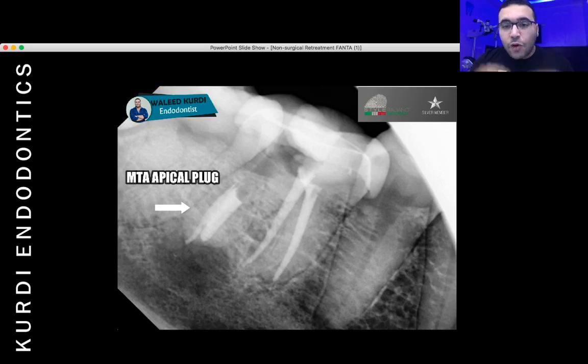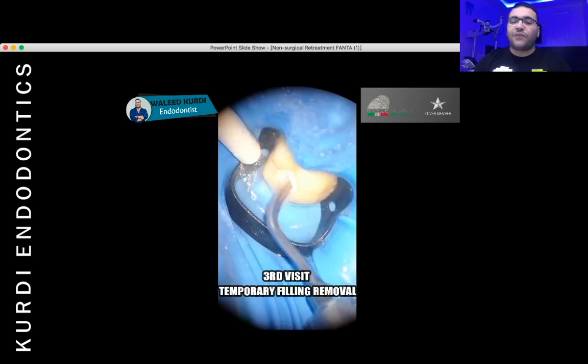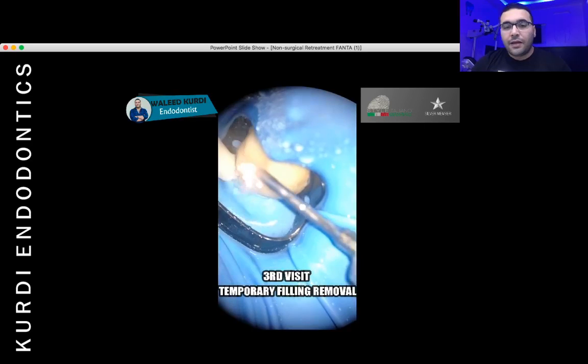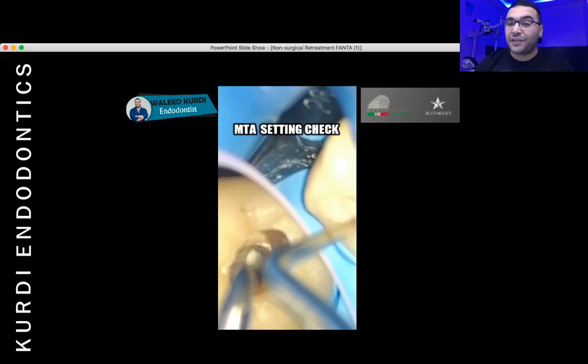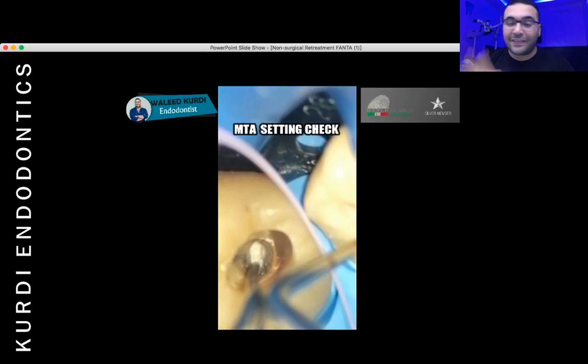As you can see, we have two portal of exits filled completely with MTA, and in the second visit the patient came to me, and by the way, this patient is a very famous VIP, and I should not mention anything more.